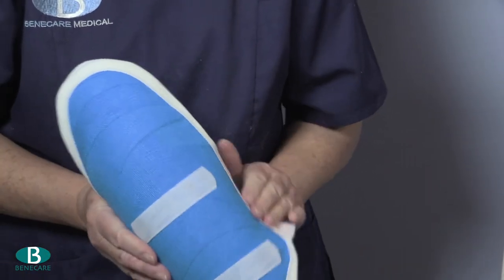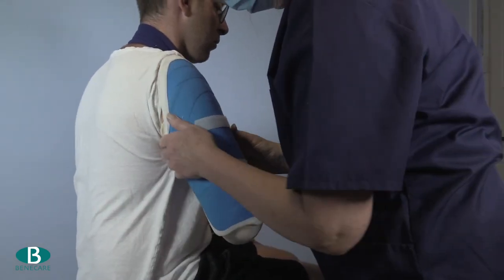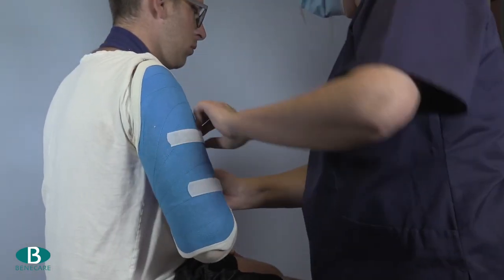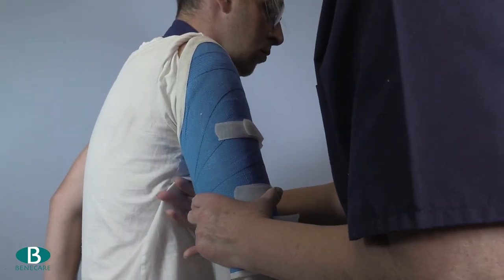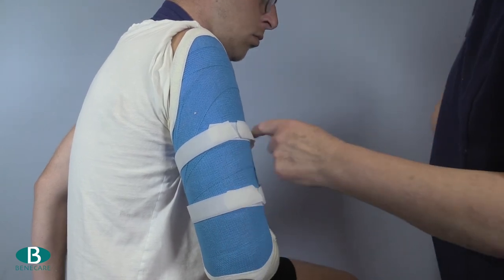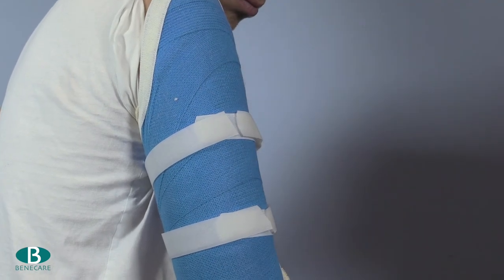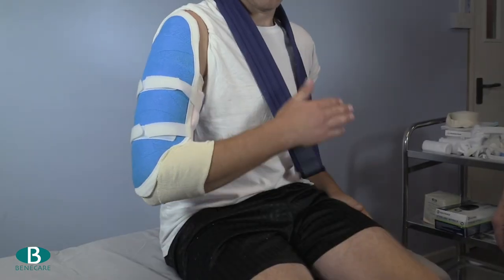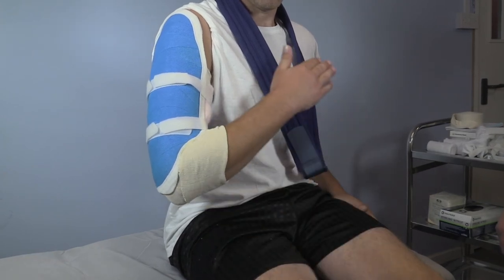Reapply the brace to the limb and add the opposing non-adhesive loop circumferentially to secure the brace. Ensure the brace fits securely, providing excellent compression and feels comfortable for the patient, and also that it does not cause constriction to the joints not included in the cast.